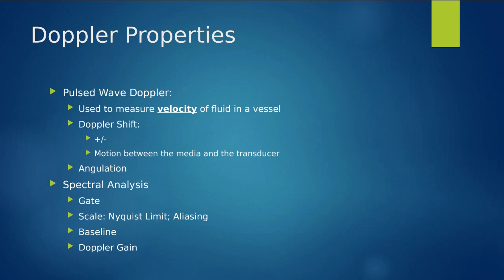So typically when we're in lab, we're putting color on something, and then sometimes I may say to you guys, let's Doppler that, right? And we put on our PW knobology, our pulsed wave Doppler, and that's when our screen changes a little bit. And then we can really evaluate what we call the velocity of whatever vessel we are sampling.